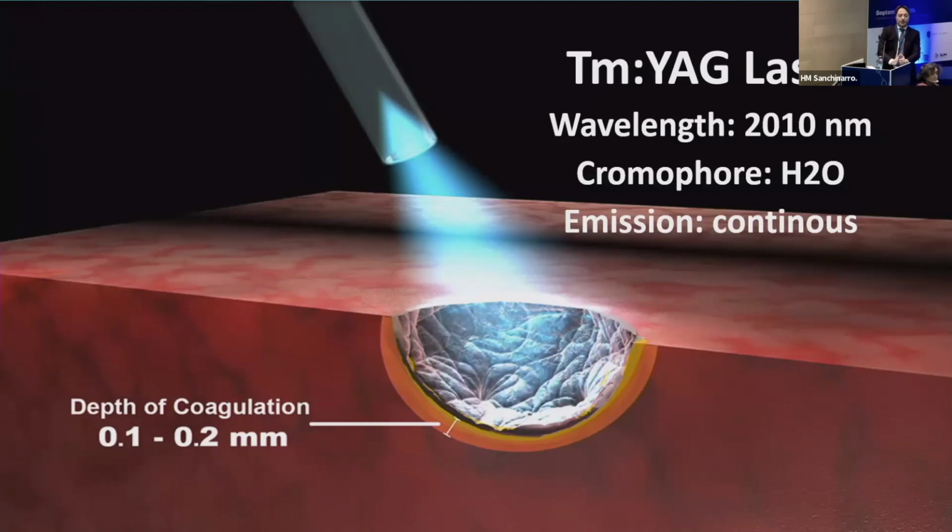If you are fast and you abandon the part that you are lasering in that moment very fast, and you are using the correct laser, you won't have any irritative symptoms, or this will last for just a few hours or a few days.